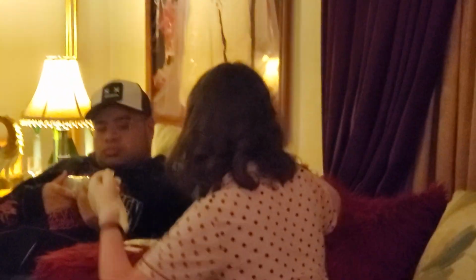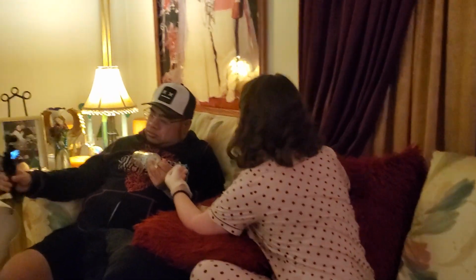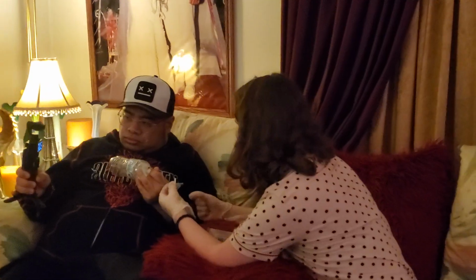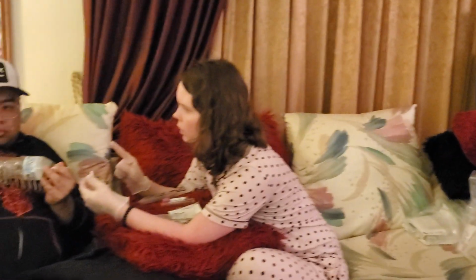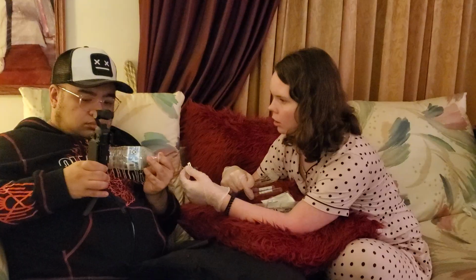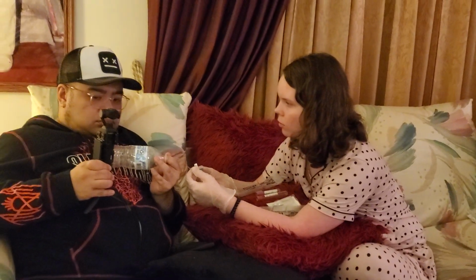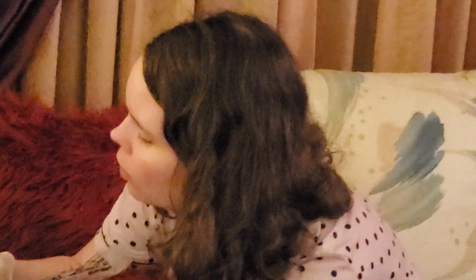Grab an alcohol wipe. Usually they have positive pressure caps on, and caps on top of those positive pressure caps. The caps that are on those pressure caps are one-time use only. So I would also have an extra cap with me. I'm just going to have to vocalize that because those things are apparently short stock.